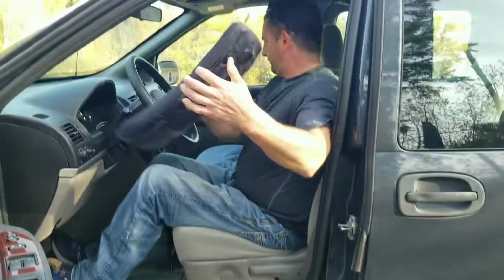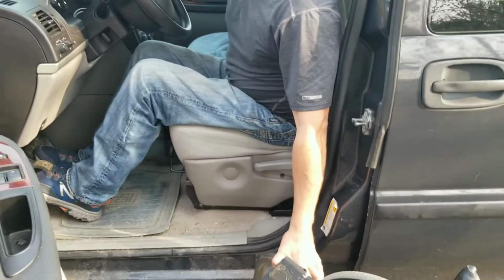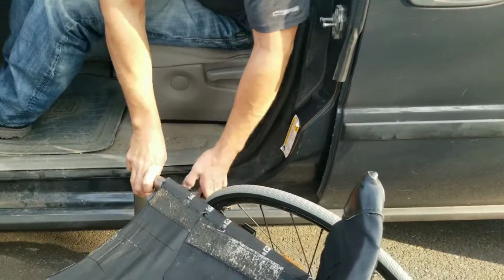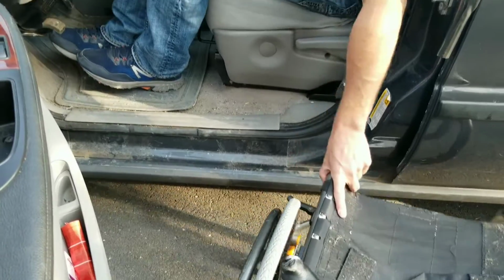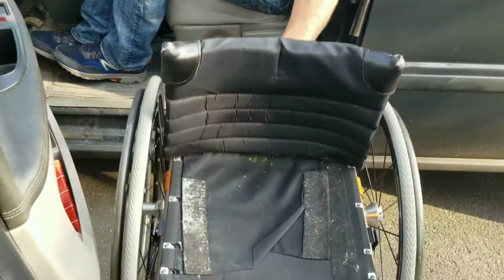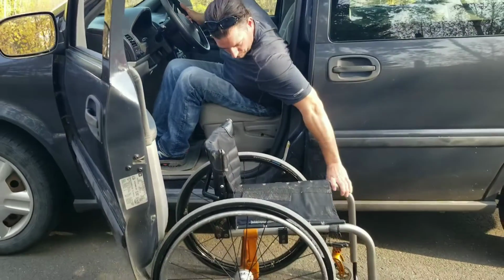Anyway, from here, keep your brakes on. Take your cushion off. I put my cushion in behind. Now I'm going to have to release my brakes, so that I am on a slope. You've got to be careful the chair doesn't get away from you. Now you can keep the one brake on and turn it around, but actually I'm going to take them both off. It'll just be easier that way.